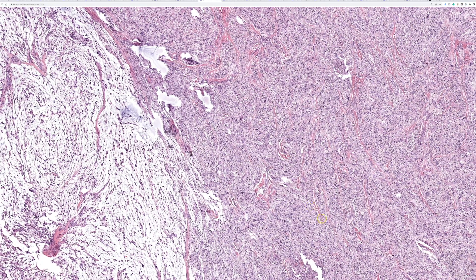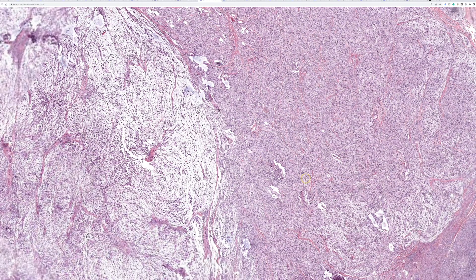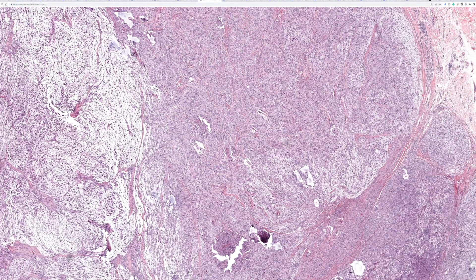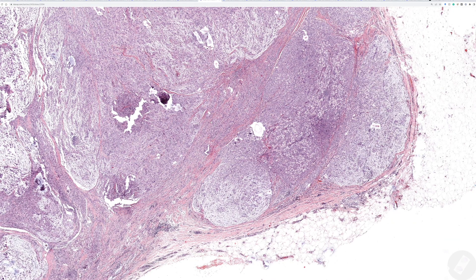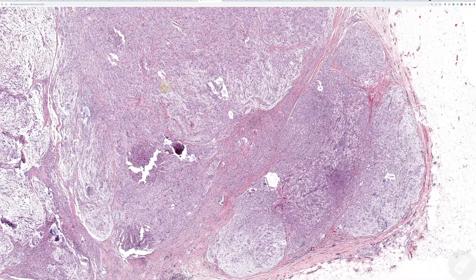The biggest struggle is how do we know for sure we're dealing with cellular neurothecoma. Cytologic and morphologic features are most helpful. Immunohistochemistry is unfortunately not terribly helpful - NKI-C3 (also known as CD63) is usually positive, and neuron-specific enolase (NSE) is usually positive, but both are very non-specific. NSE stains all sorts of things - I personally find it worthless and essentially never order it. Vimentin is similarly in that category for me - I don't look at those stains.